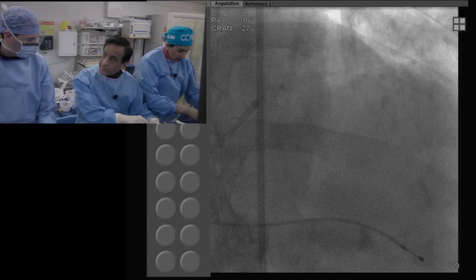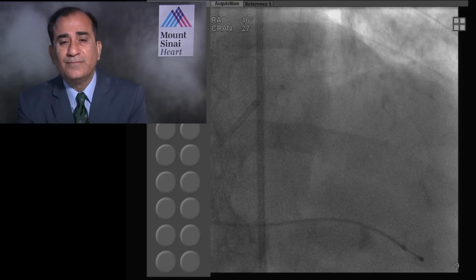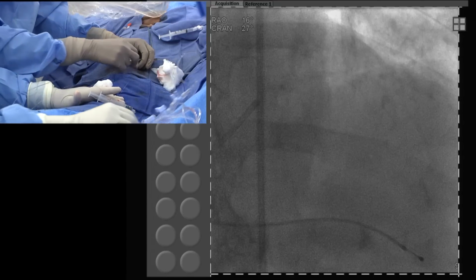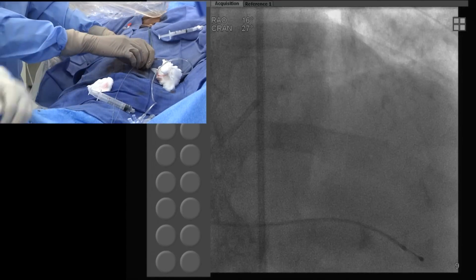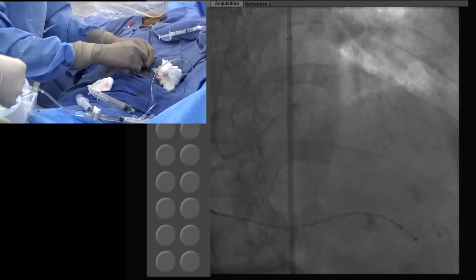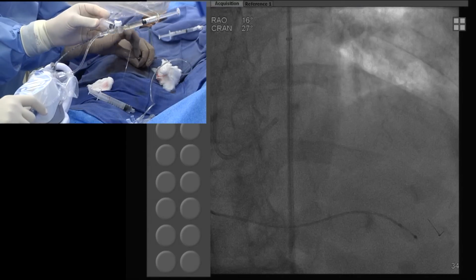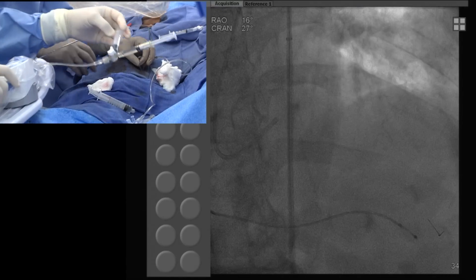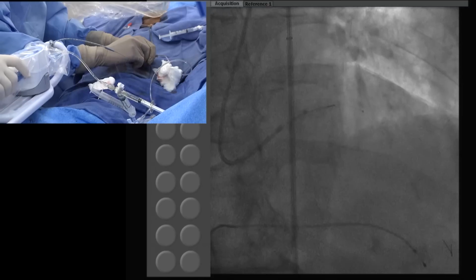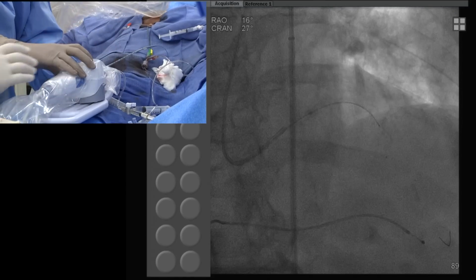Samin, then another very interesting question comes from Oman. We've had the first one from Libya, second from Oman, and this question is: was a CT angio done to better evaluate this aneurysm? I think the answer is that the aneurysm has definitely increased and had not been seen to this level 6 months ago. Absolutely. But the question is, even if it's an aneurysm, it's not going to change our practice. The patient needs intervention. Good observation that it may have been a good way to evaluate.